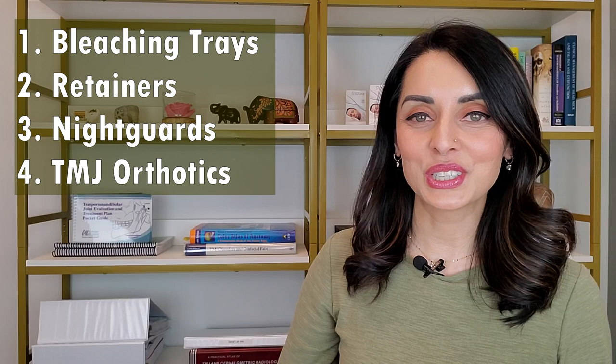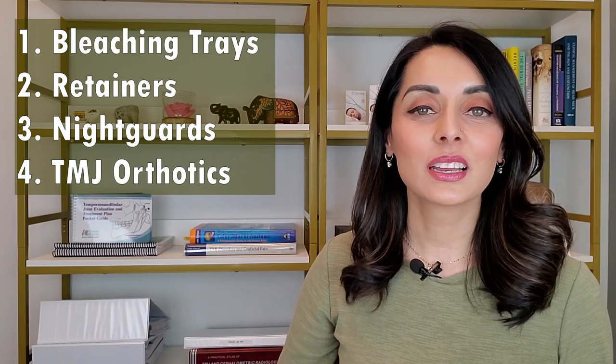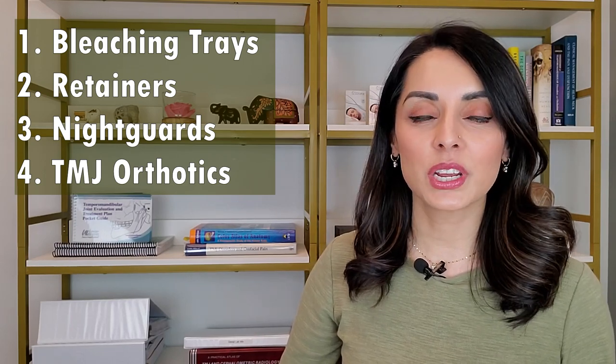For those of you who don't know me, I'm a general dentist with a practice in Vancouver, Washington — that is close to Portland, Oregon. At my practice, we are dedicated solely to taking care of those with TMJ disorders. So now let's get right into it. The four types of appliances I'll be talking about in this video are bleaching trays, retainers, night guards, and TMJ orthotics.